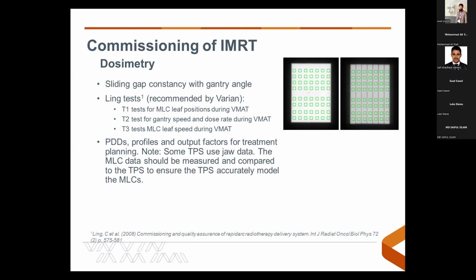And important for IMRT and VMAT is you need to do your small field measurements, because during IMRT delivery, you can get a lot of small segments. So your small field model is important in your IMRT and VMAT delivery, as well as your SBRT treatments as well.